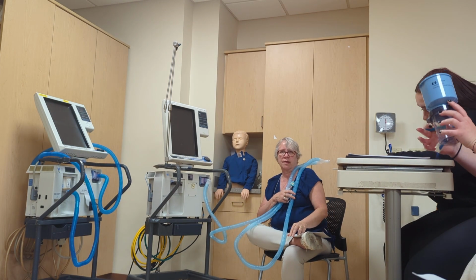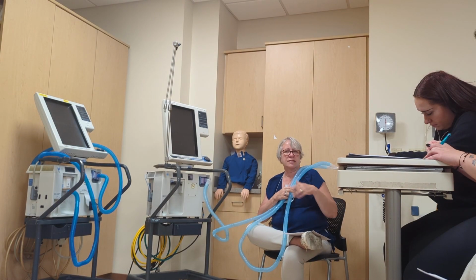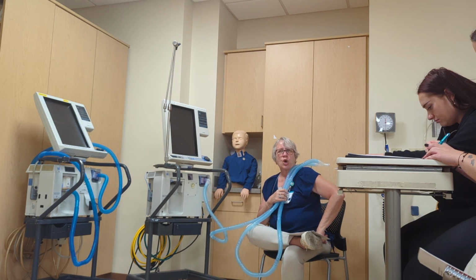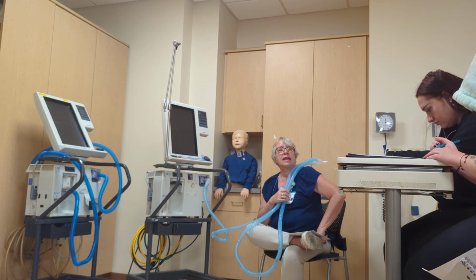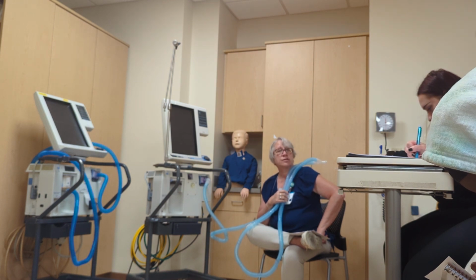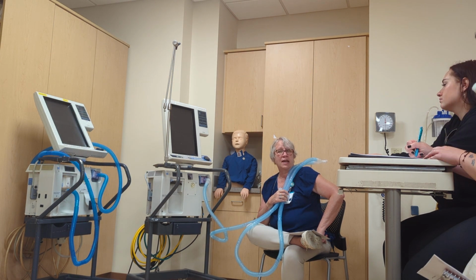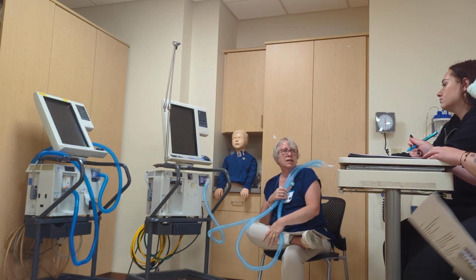That's a dump bottle. And the dump bottle is used to gather condensation, all right? Anymore, we use either HMEs or heated wire circuits, and that reduces condensation. But if you get a lot of liquid in your ventilator circuit, you will dump it into the dump bottle.